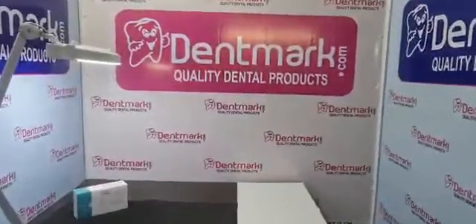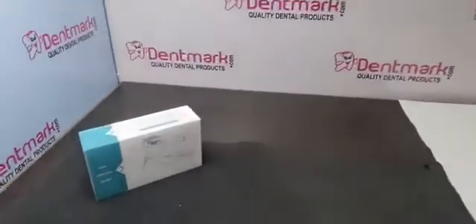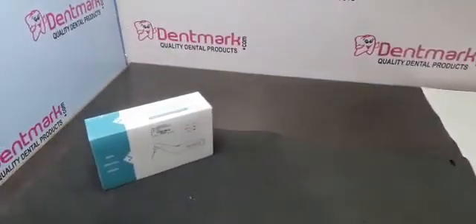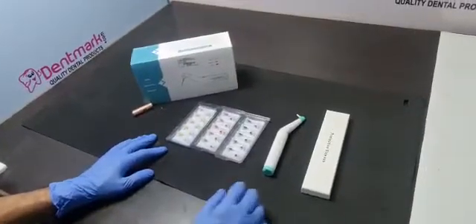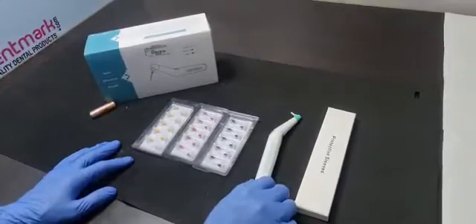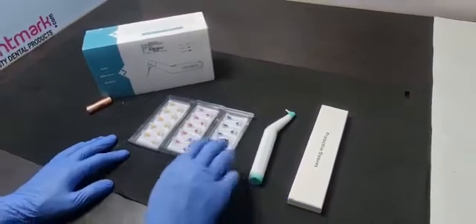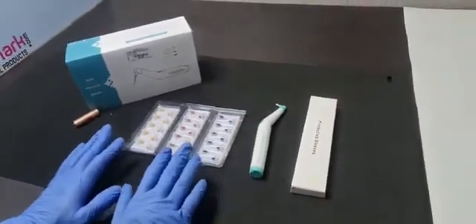Hello friends, here is a new product — the Dentmark ultrasonic endo activator. I will tell you what things are included, how to use it, and how to insert the battery. You can see protective sleeves, an ultrasonic endo irrigator or sonic irrigator, and a set of 30 tips — or it comes with 60 tips, you can buy either one.